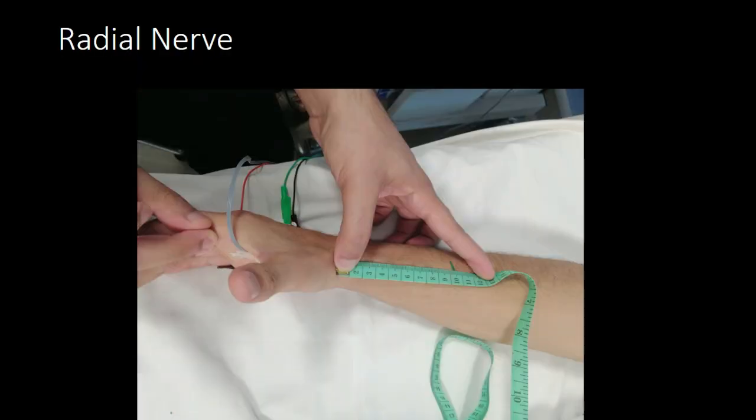So this is an anatomical snuff box measurement. Again, you're gonna measure the distance, 10 centimeter or 9, and then you're gonna stimulate it. So see, if you are keeping your hand like that, you're already reducing the distance. So it should be in a normal anatomical position.